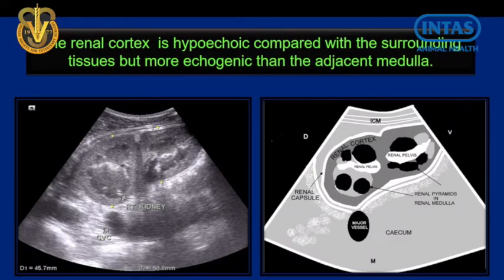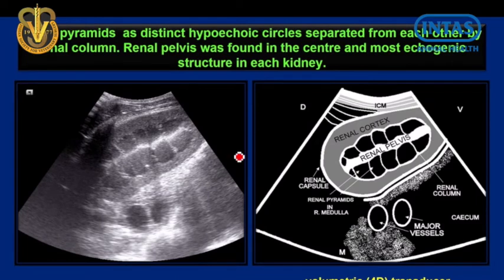Okay. Now, this is the cortex here. You can see the pelvis. The kidney is different from the canine, because whoever is doing sonography does it for canine, bovine and equine also. But whenever you do kidney sonography, always first look into the anatomy of the kidney in the different species, and the species differentiation also. So this is how the kidney looks, and this is a clearer picture.